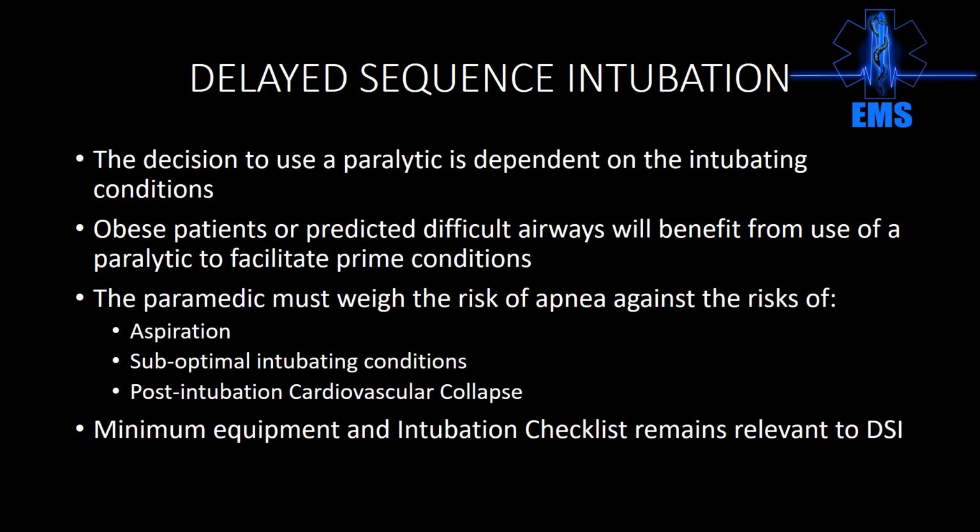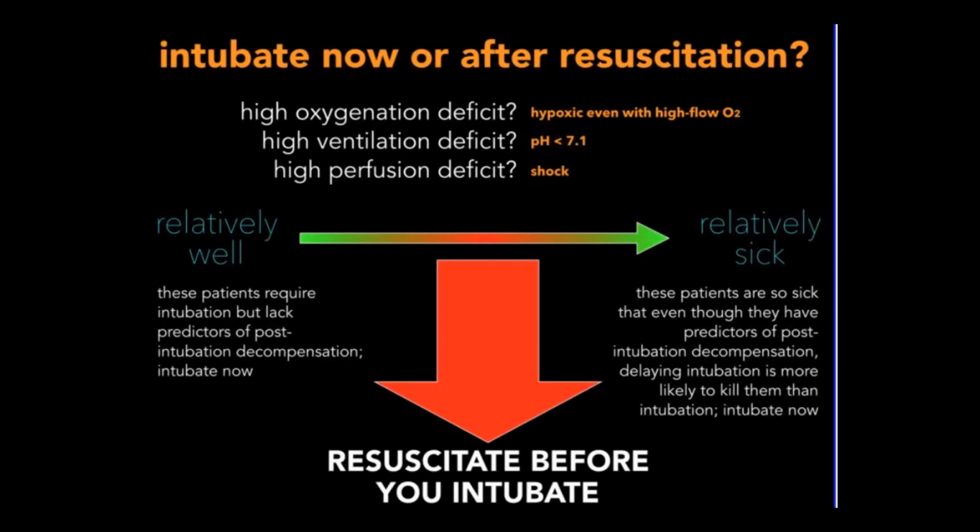minutes. Obese patients and predicted difficult airway patients may benefit from this because, again, we get a free look without actually committing. But you have to weigh the risk of aspiration, suboptimal conditions, and post-intubation collapse from under-resuscitation with DSI. The minimum equipment and the checklist still pertain to DSI.